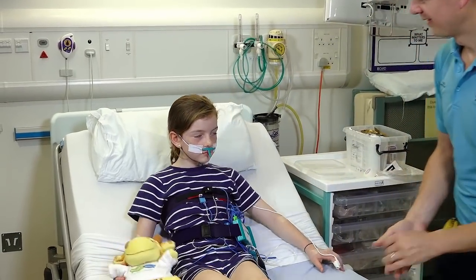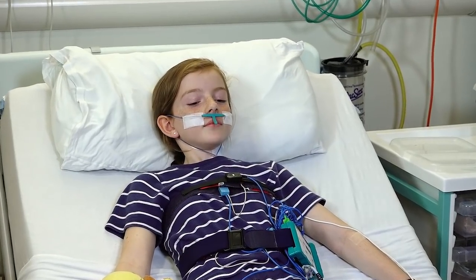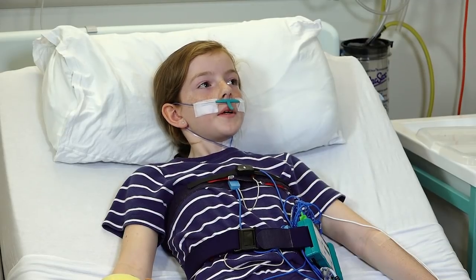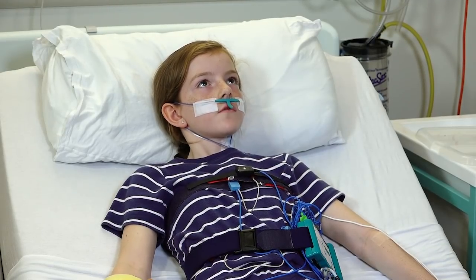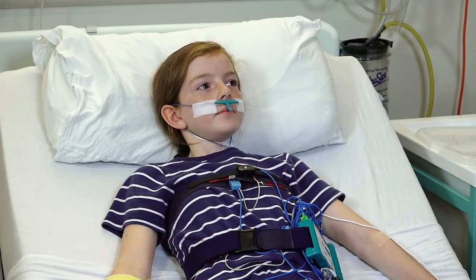Your job now is just to have a little snooze. How does that feel? Yeah, not too bad? Is it what you thought it would be? There was more than I expected but it doesn't feel like there's loads of things stuck to me. So you'll be able to sleep with that? Yeah, fantastic.